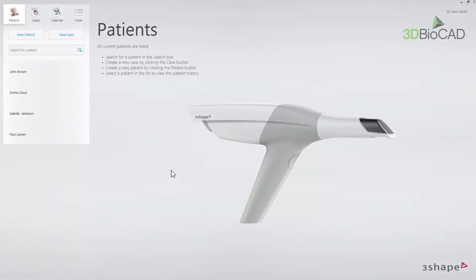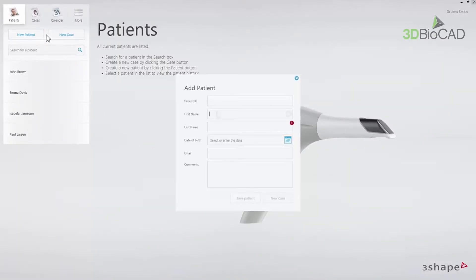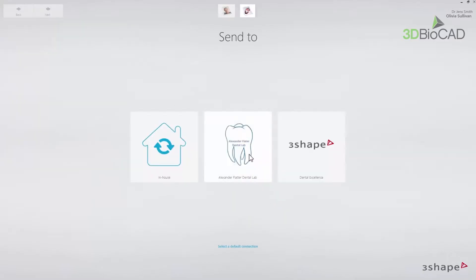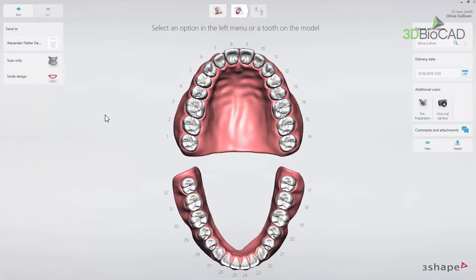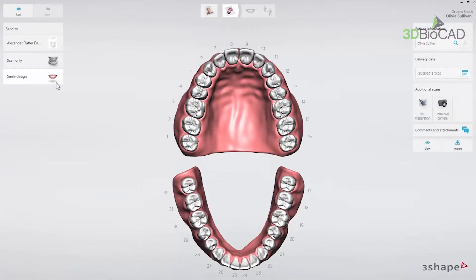Start by opening your application and adding a patient and a new case. Then, when in the order form, click the Smile Design tab in the indications list.